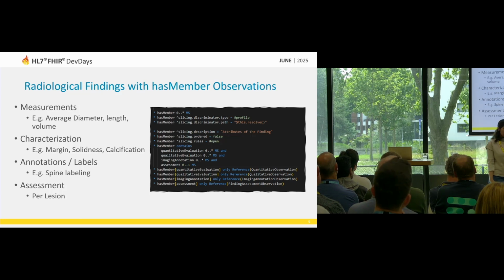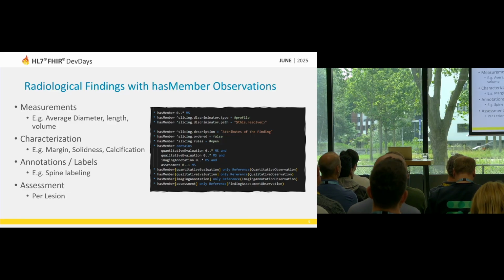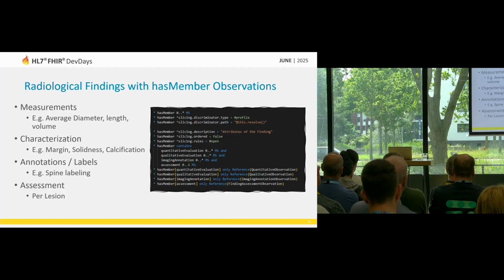And with the component, when you are starting and you are digging in very simple use cases, then it is very straightforward, and you say, sure, we can do it there. So I just need to say slicing, and then I am done. It really doesn't work out well when you want to report complex findings, because there are measurements that are derived from or based on other measurements. There you need to have more robust structures.